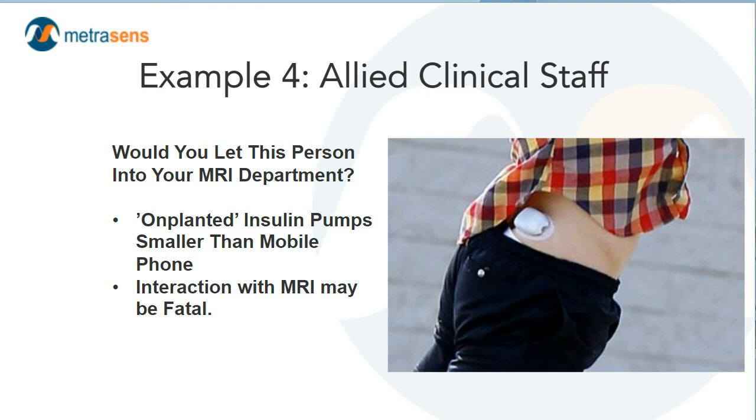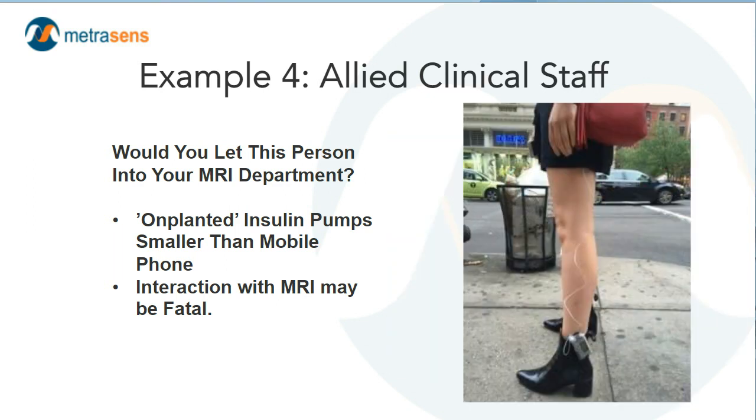Here is a different insulin pump, and you can actually see the pump device clipped to this person's boot. And you can see the tube that goes up to the tiny catheter that is probably embedded at the abdomen or around the waist. So the device itself doesn't even need to be at the location where the drug is being introduced to the patient.